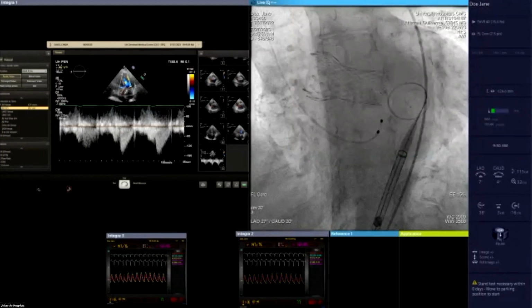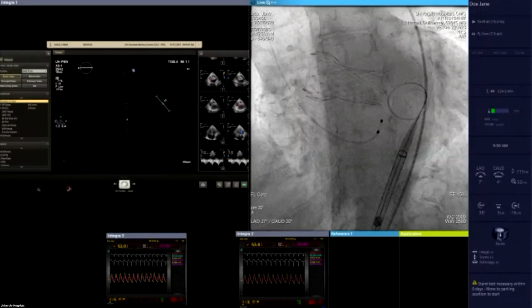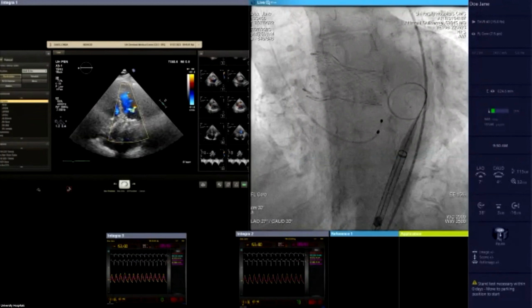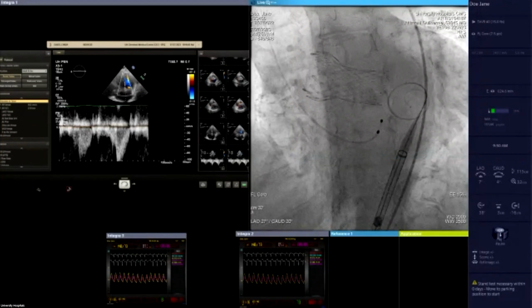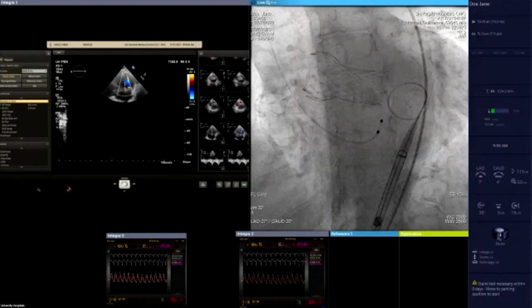We're going to have to leave you in a few minutes. Dr. Frank, you have a comment? Yes, I have just a question to you. What I saw, you didn't perform X-ray control of your valve. So we do this in our cath lab routine.